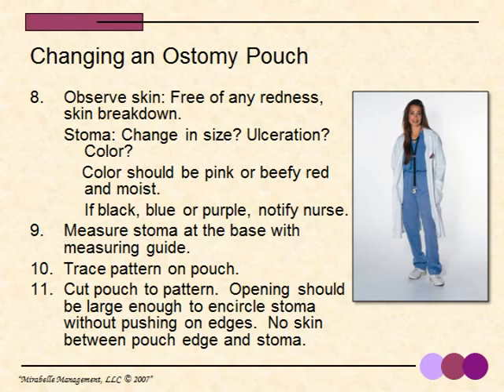Measure the stoma at the base with a measuring guide, and then trace the pattern onto the pouch. You want to cut the pouch to the pattern. The opening should be large enough to encircle the stoma without pushing on its edges. No skin or very minimal skin should show between the pouch edge and the stoma.